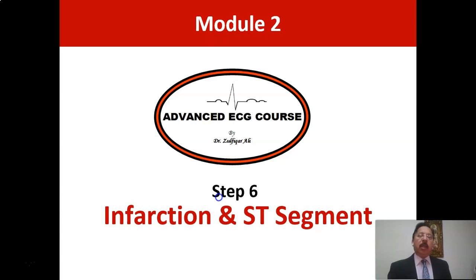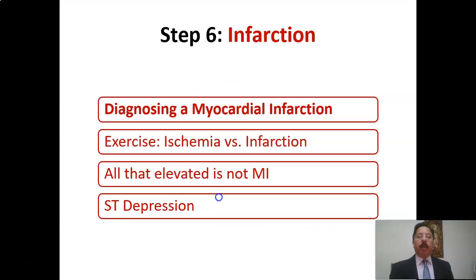Here in step 6, we'll talk mainly about the ST segment, and we'll learn how to diagnose a myocardial infarction. Then we will have an exercise named ischemia versus infarction. Then we'll review that not all ST elevation is myocardial infarction, and ST depression.